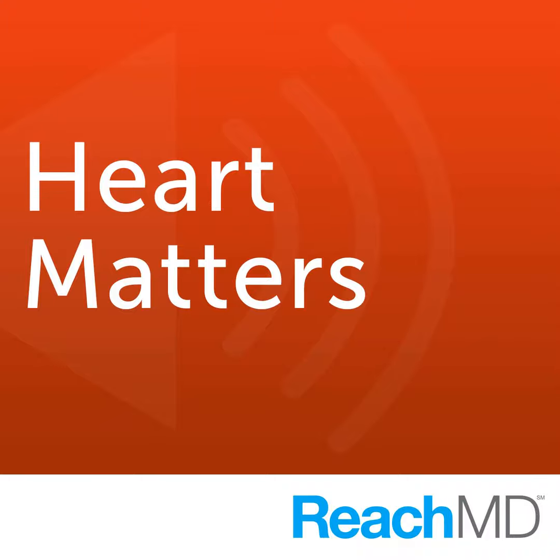The way that you control the data and control how you move it is all done through a gaze-dwell mode of control. So instead of using your hands or pointing and clicking or talking to it, which technologically will probably be ready with natural language processing in the next couple of years, where at least our fingers are crossed and we're hoping that's the case, this is actually done purely by gaze dwell, which means that with slight movements of the head, you're able to control and select menu items and manipulate your data.